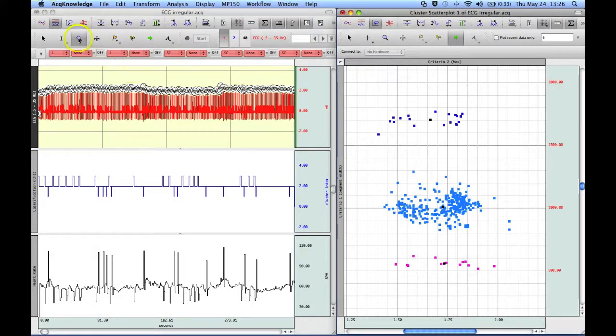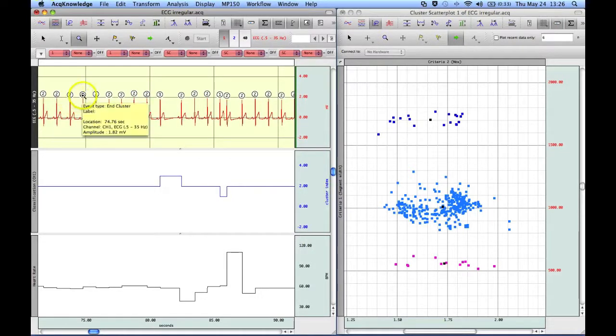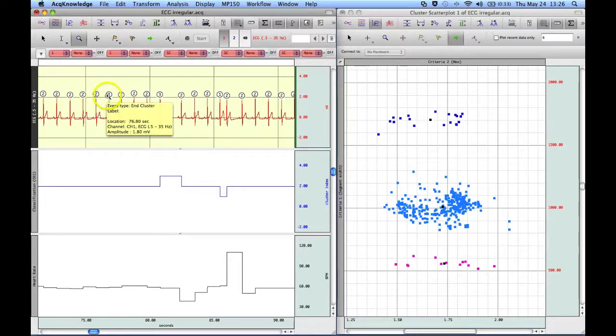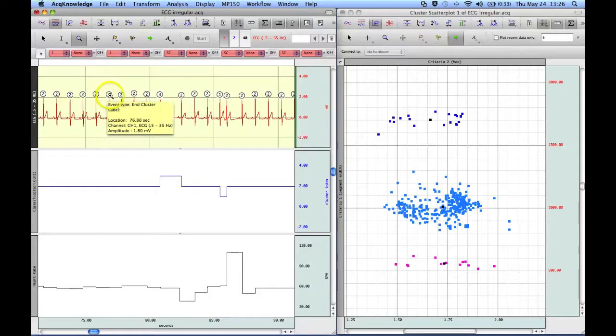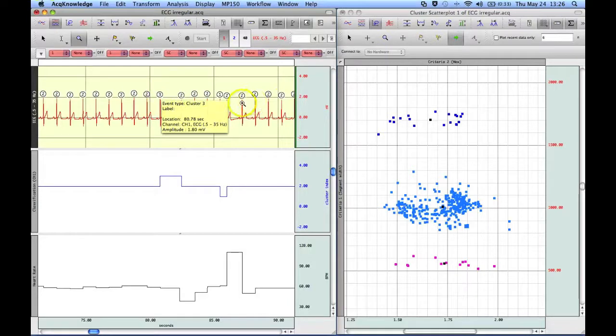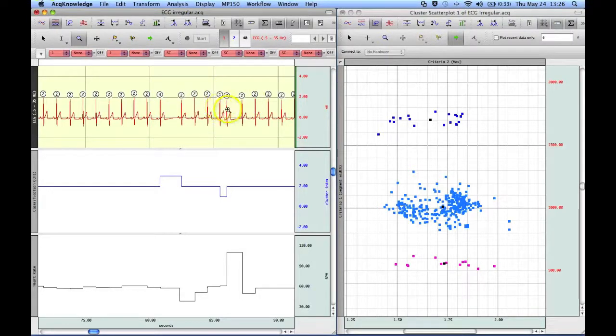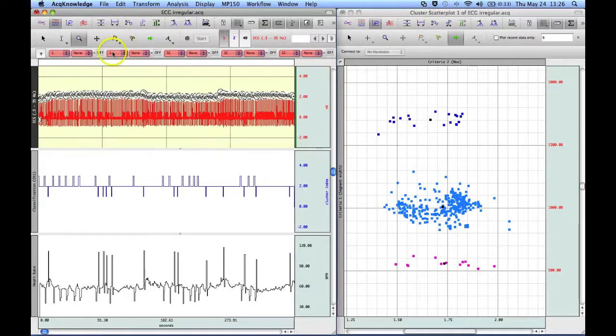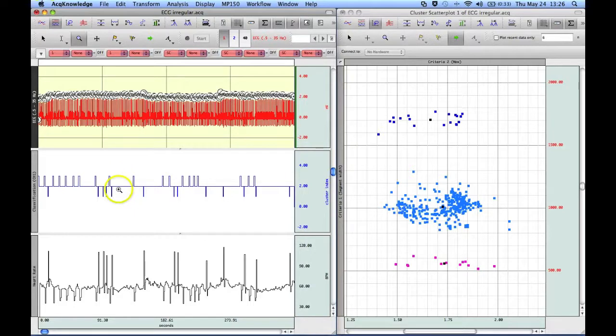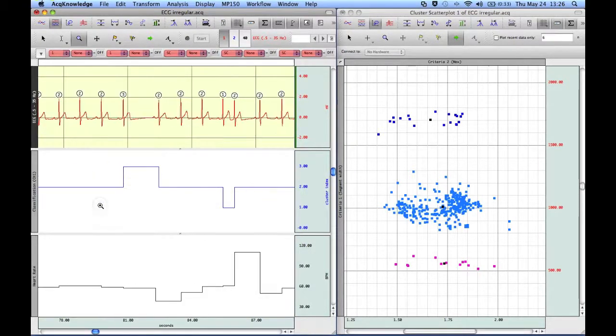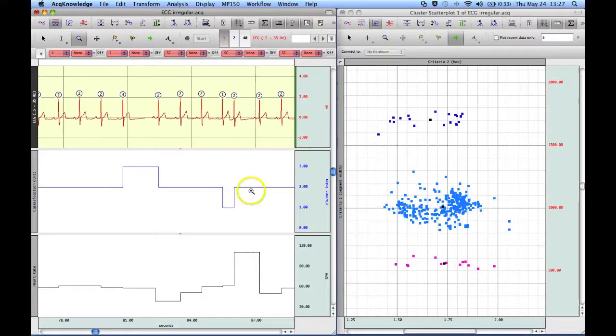But before we get to that, I'm going to zoom in on our original data. And we can see that the software has put event marks on each of the R waves with the grouping. So these are all considered group twos or cluster twos. This one here is considered, and here's a faster one over here, a shorter interval cluster one. Again, if I can press down, this channel here displays where those ones, twos and threes occur. So if we zoom in just down here, there's a three going high and there's a one going low and then two is through the middle.